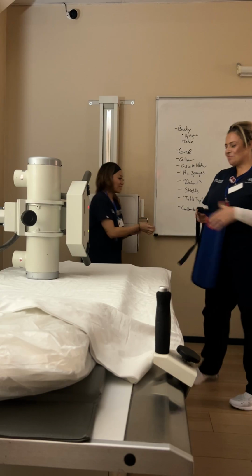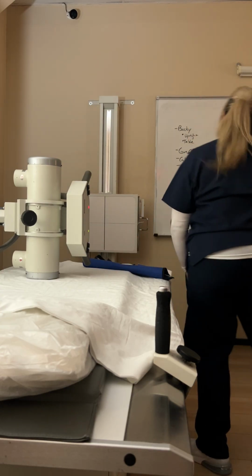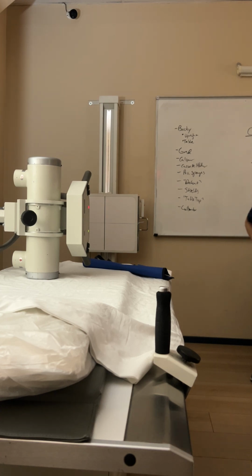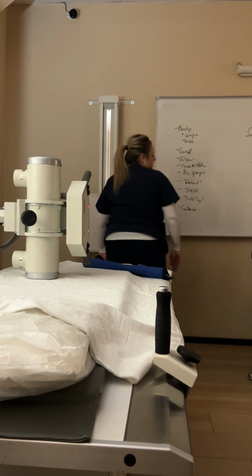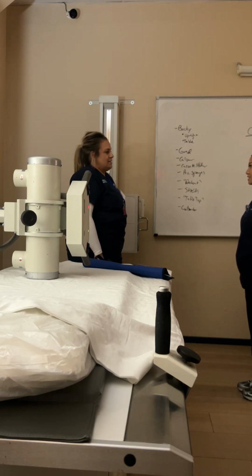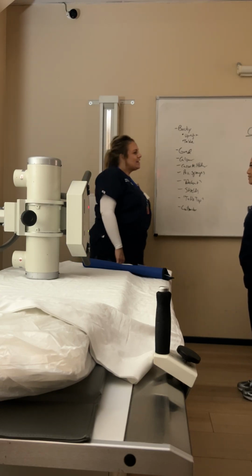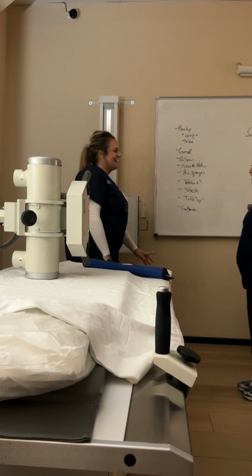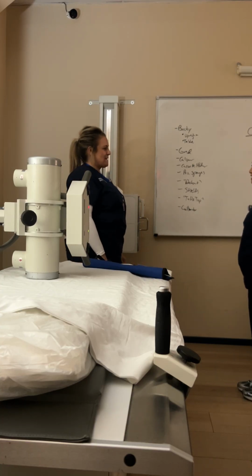I can't tell your results. Markers there, shields on. Take a deep breath in, blow that breath all the way out. Okay. You can relax. You're good, Tia. Thank you.